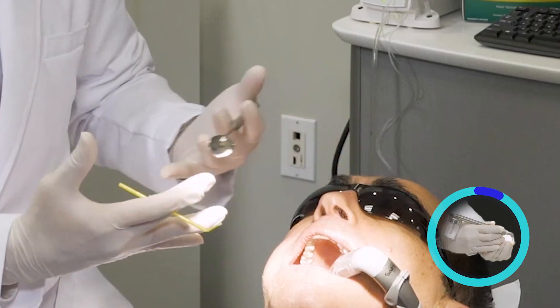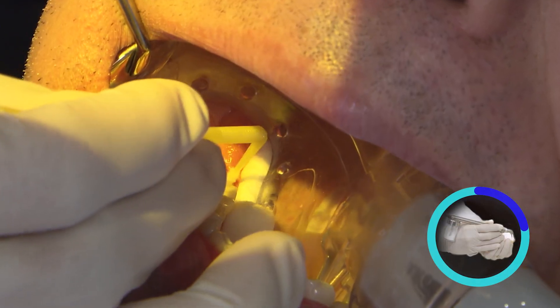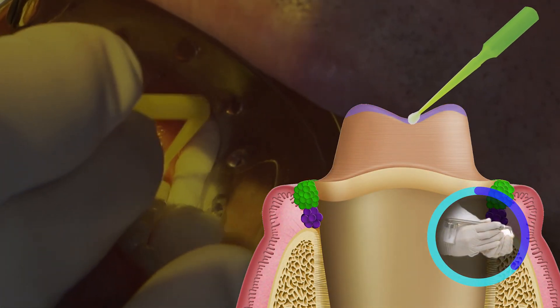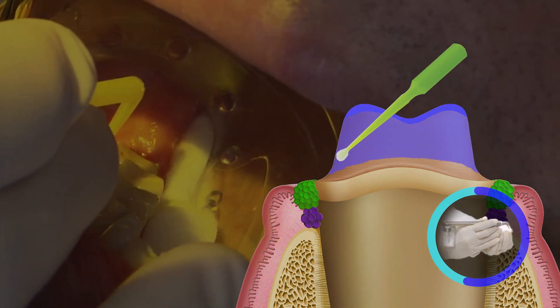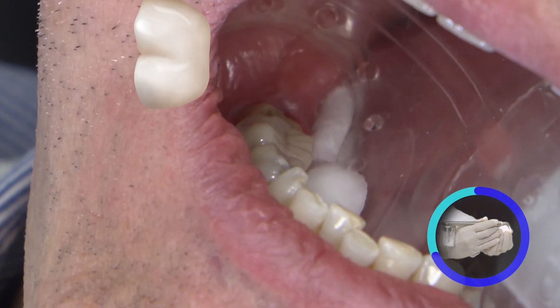We obviously want to keep things isolated. I normally finish with the margin. So I start off on the occlusal surface and begin working my way down the axial surfaces of the prep. And the very last thing I try to touch will be the margin. Now we'll get the restoration.